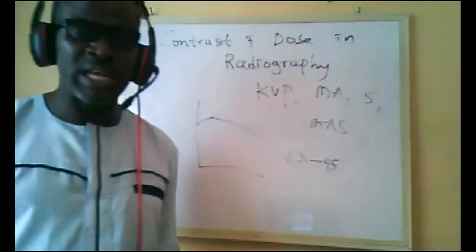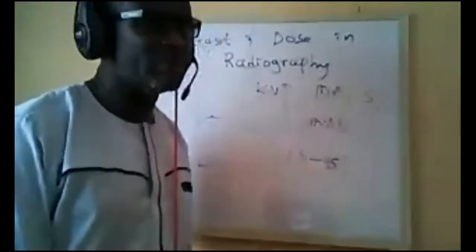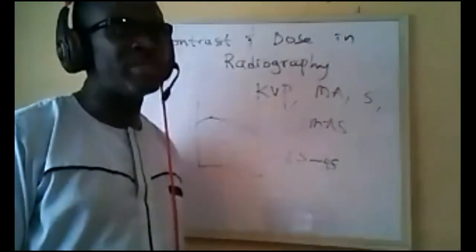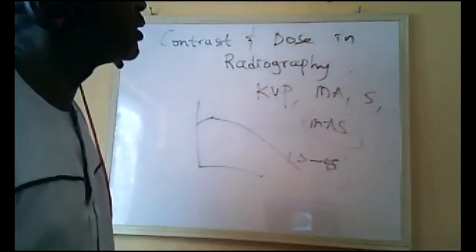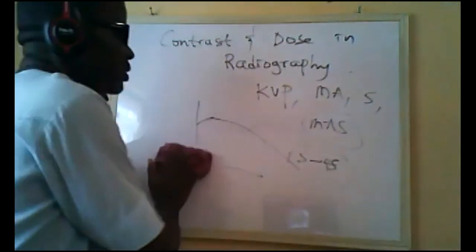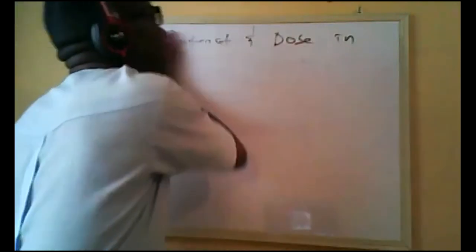But with time, the experienced radiographer would have known what he needs when he sees an obese patient. These are the factors needed to have a very good radiogram, so that the retake rates are seriously reduced.